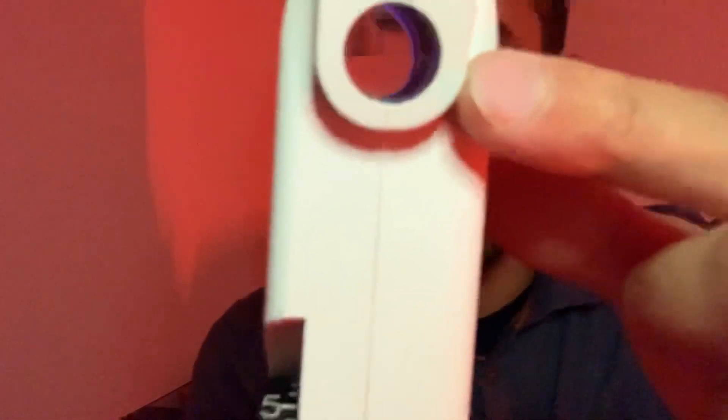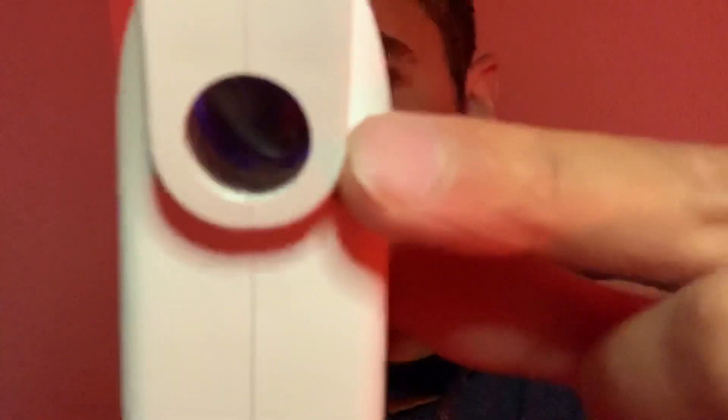I have my viewing window here where I will be looking at the mires that are produced and just trying to align them to obtain the pressure reading. In the base here is where the batteries are housed to give power to the Perkins.